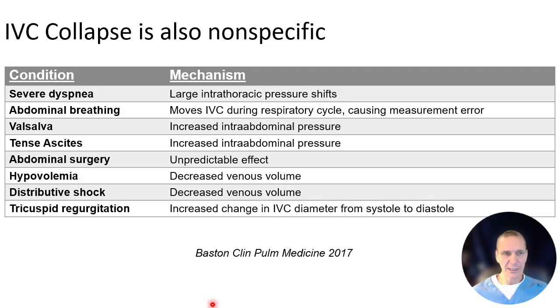Remember, IVC collapse is also very nonspecific. A lot of things can change how the IVC looks and its collapsibility. Severe dyspnea, the way a patient's breathing, all these intrathoracic pressure shifts can all change the IVC.